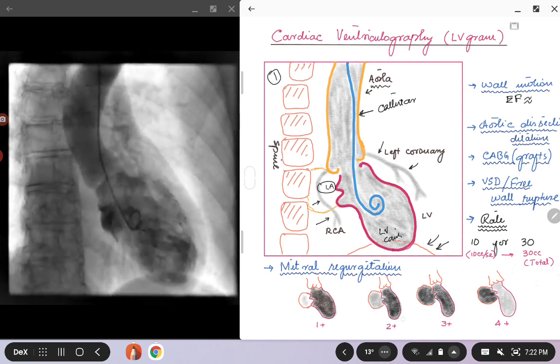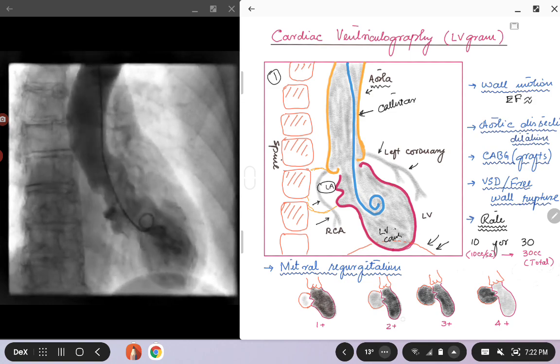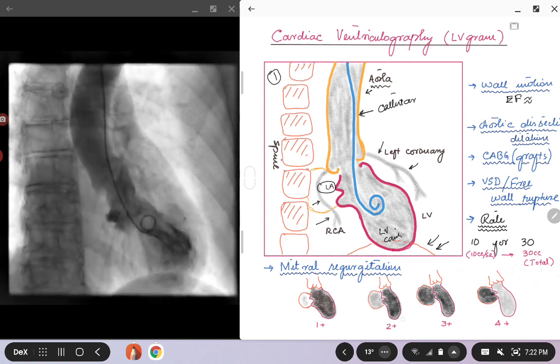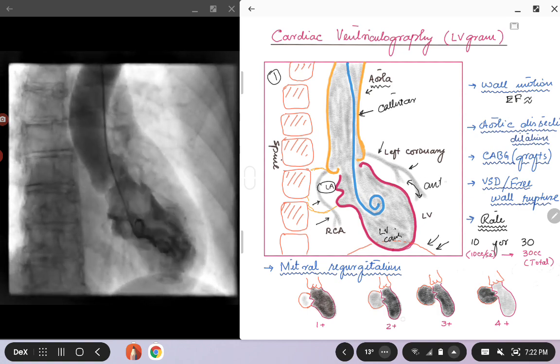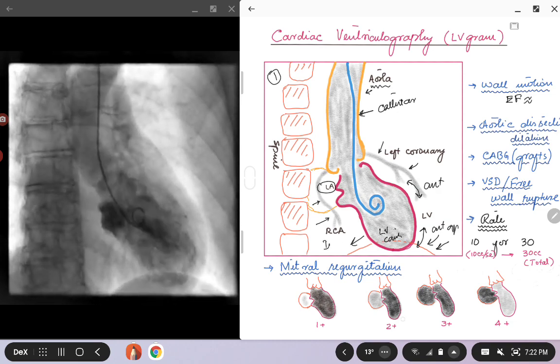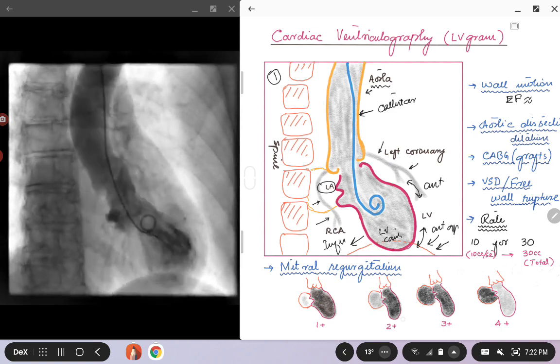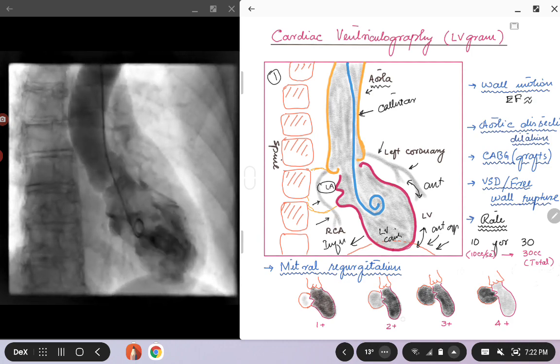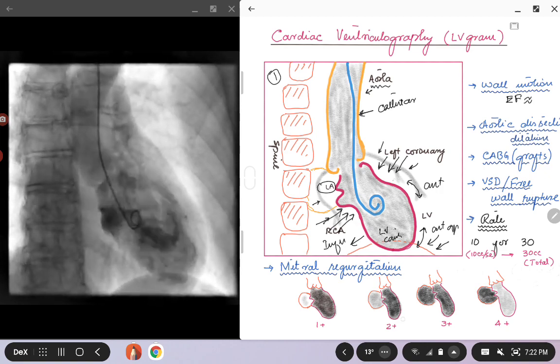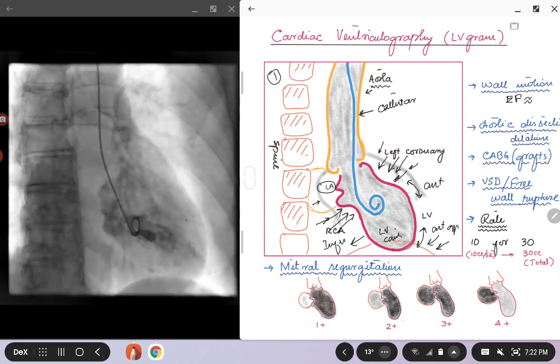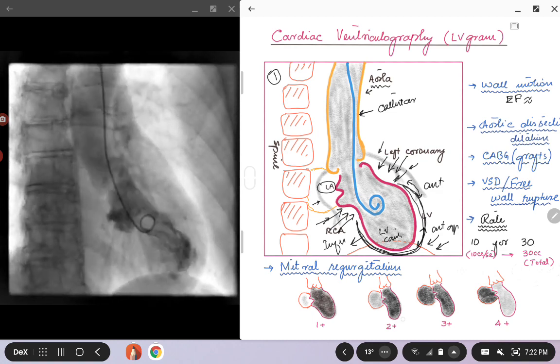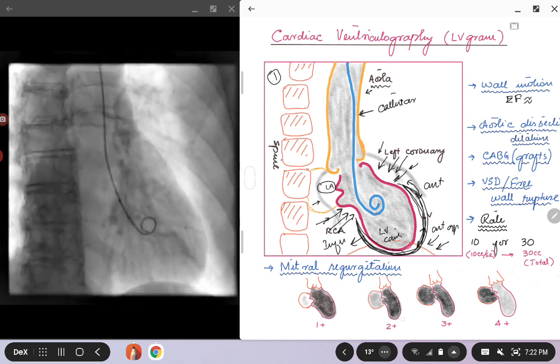I have picked this cine loop for a reason — I want you to pay attention to the wall motion. I'm going to label this: this is your anterior wall, near the apex is your anteroapical wall, and then you have the inferior wall. If you look at this cine loop on the left, you will see an abnormality. The basal portion of the heart is moving while the entire anteroapical and inferoapical region — I'm drawing a circle around that — is hypokinetic or not moving at all.